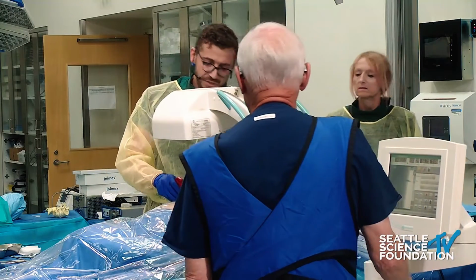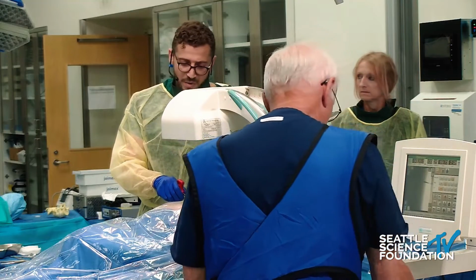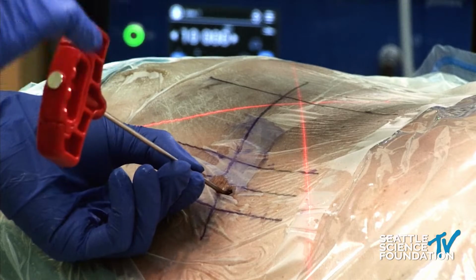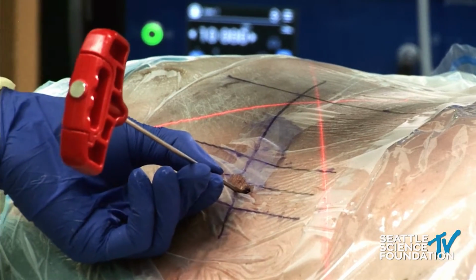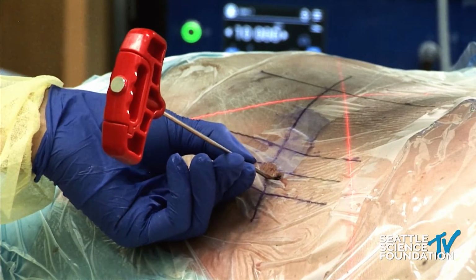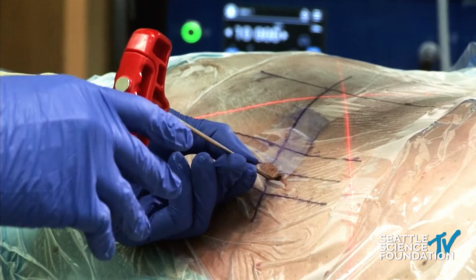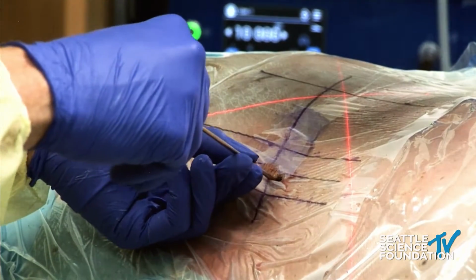So what you want to do is you either use a Jamshidi needle or use a spinal needle. Either way works. I usually like to use the Jamshidi needle because you could either do the trans-SAP approach or you could do the transforaminal approach. And a patient like this has a humongous foramen. I always aim for the SAP, but I bet you I'm just going to slide right into the foramen. And if that works, then it's all good.